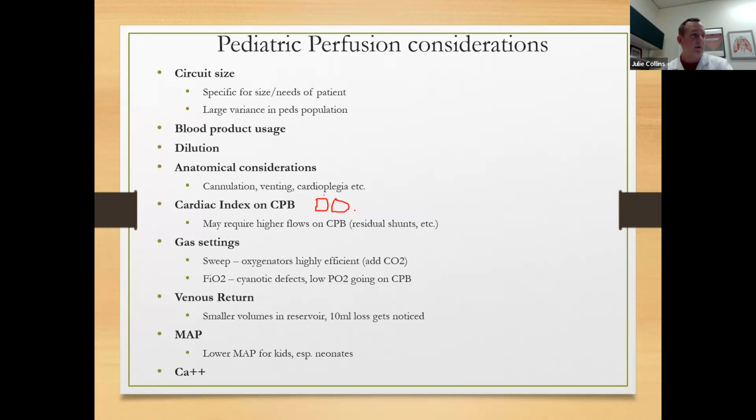D.O2I, what is that? Our oxygen delivery index. So as perfusionists, basically D.O2 is what you're doing.